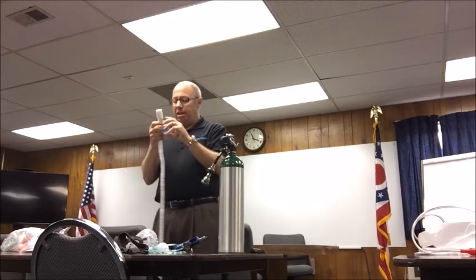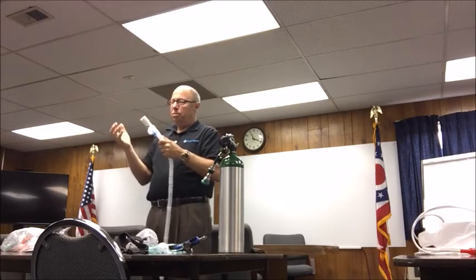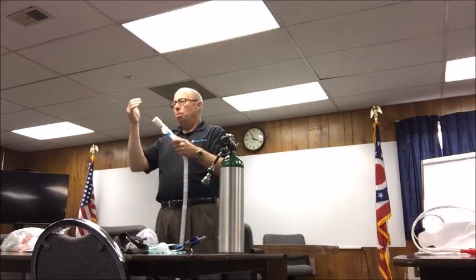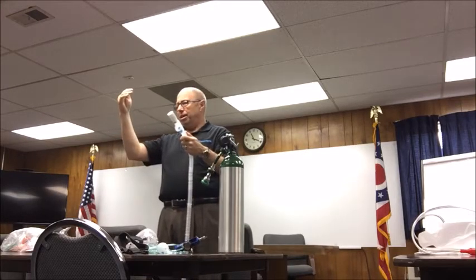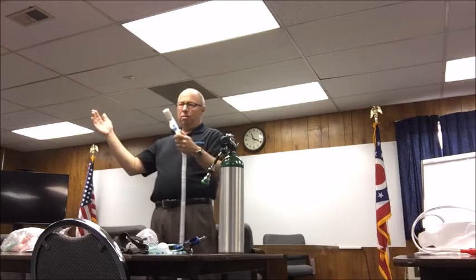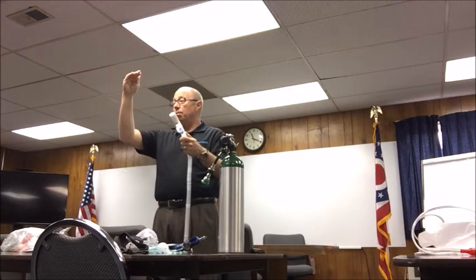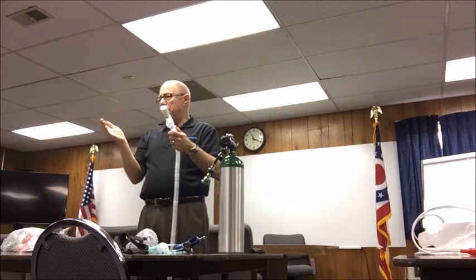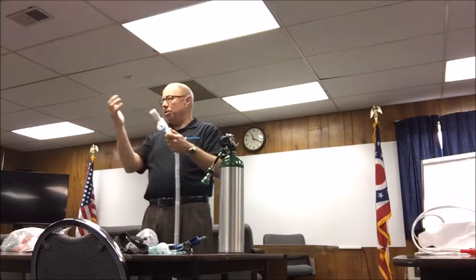Most of your patients, I'm a big believer in starting low and working up. The literature suggests that when people are in crisis, CHF, their PEEP pressure drops about 2.5. As we sit in this room right now, our PEEP is about 5. So if you have that patient at 2.5, and you hit them with 10, that's like giving 10 milligrams of morphine if 5 is going to work. Start low and work your way up because it gives you a place to go. You're going to cure about 40 to 50% of the patients at 5 centimeters of PEEP, quite honestly, but it gives them that time to start getting acclimated to that pressure.